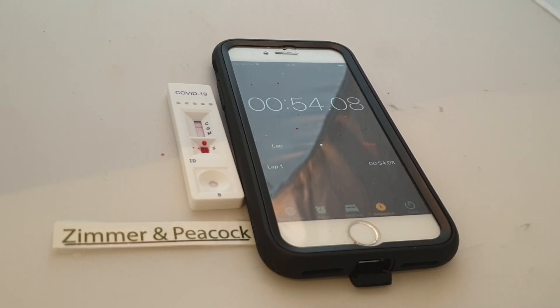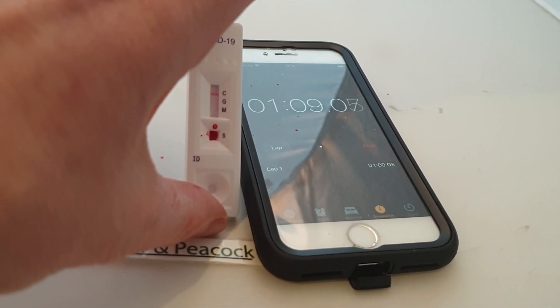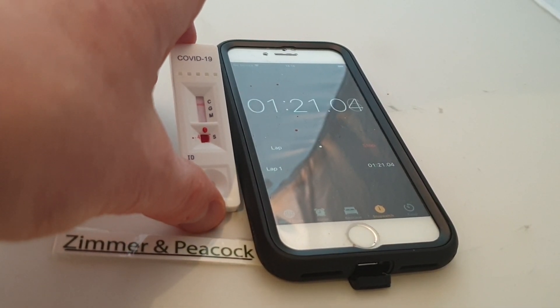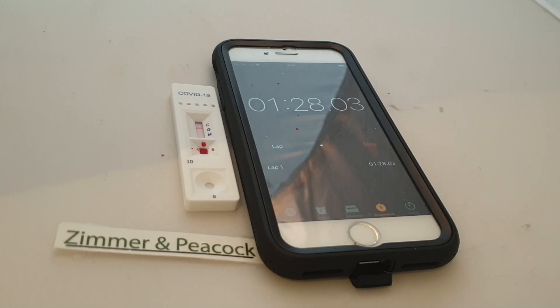I can see that the control has gone quite pinkish — I'll put some photographs up of this as well so you can see that. What I'll do is just slightly tilt the device towards you. So at the moment the control is working and has gone pink. But I'm looking for new bands on the G and the M. The G and the M have not developed any bands yet, so basically I'm negative — which means I haven't had the virus so far and haven't developed the antibodies towards the virus.